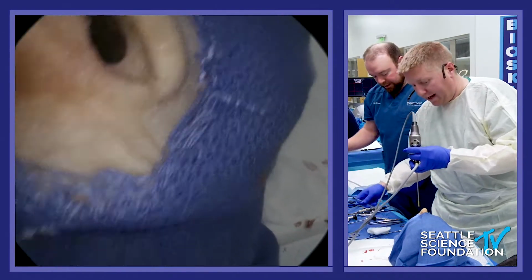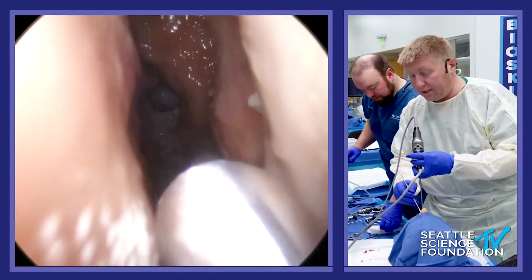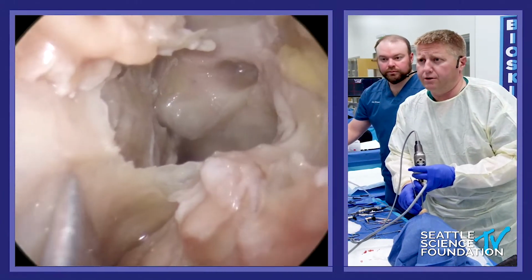At this point, you want to gain access to the contralateral side. And so you're going to need to do a posterior septectomy.